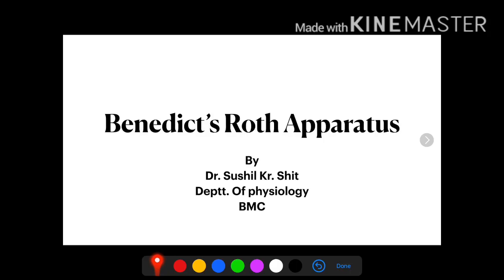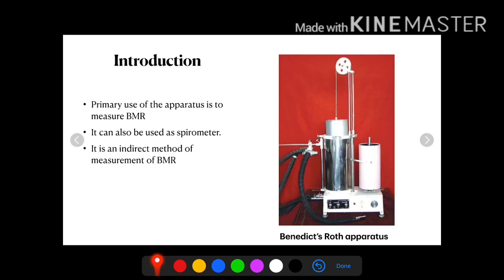My dear student, we shall discuss the Benedict Roth apparatus. The principal use of this instrument is to measure basal metabolic rate.